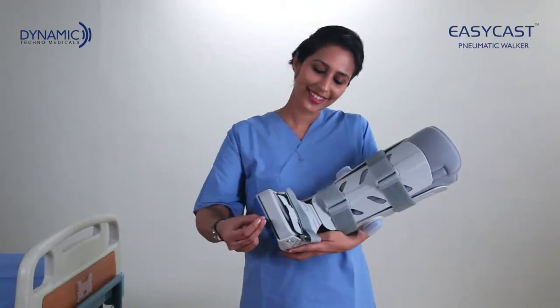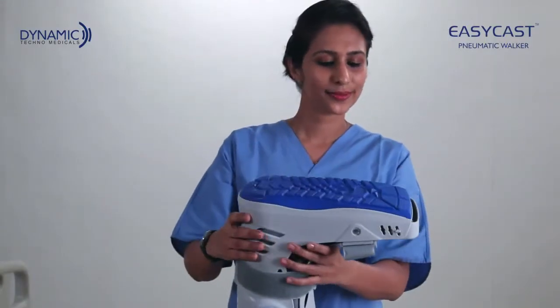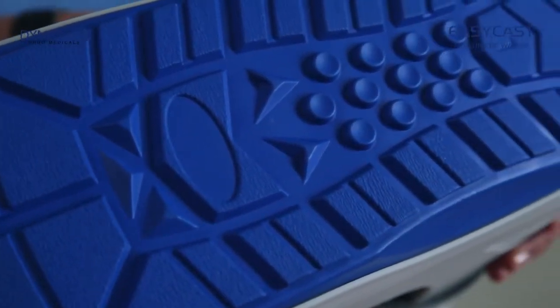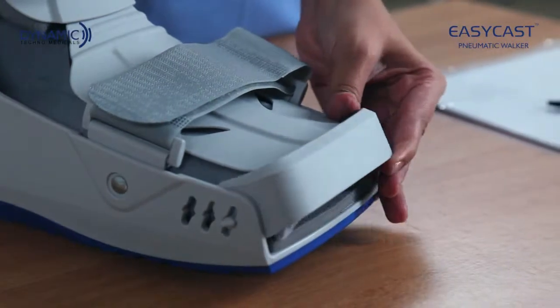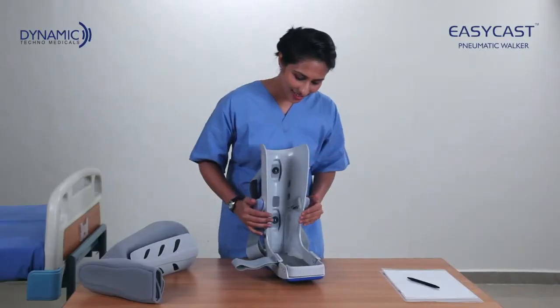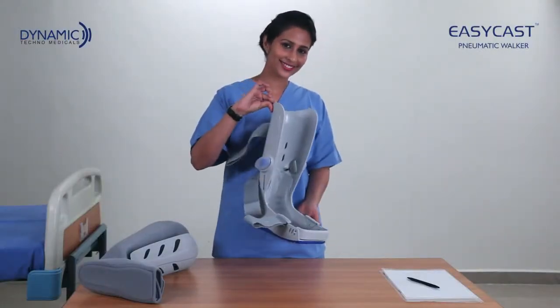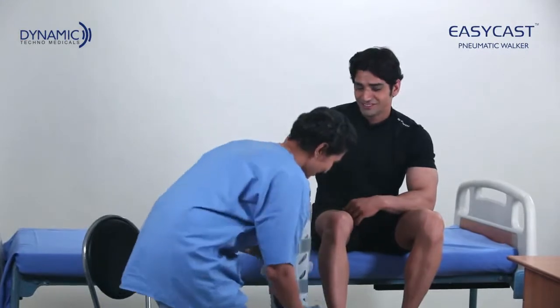EasyCast has a wide footbed for comfort and stability. The anti-skid rocker bottom promotes a natural gait, and an adjustable toe bumper provides protection. The edges are smooth and therefore comfortable. EasyCast is lightweight and has a durable shell for protection.